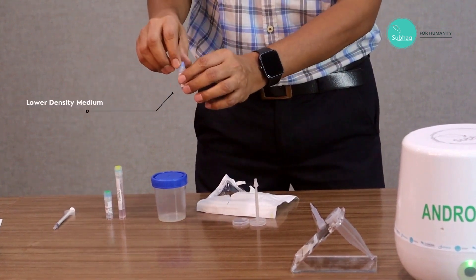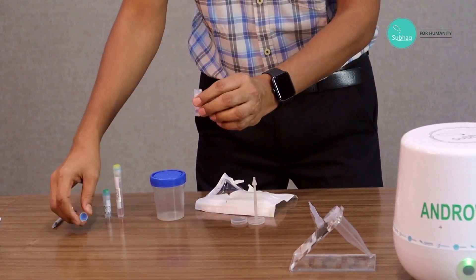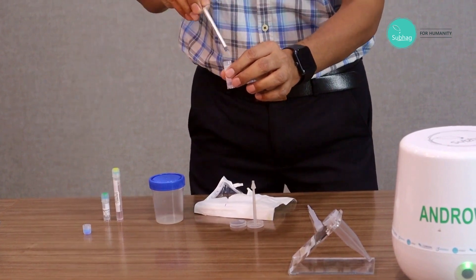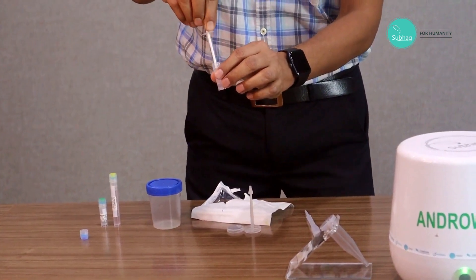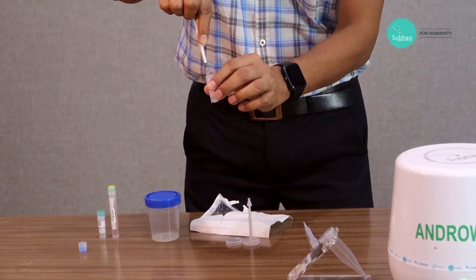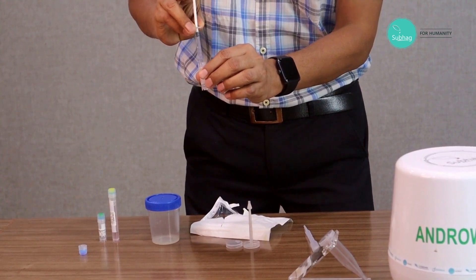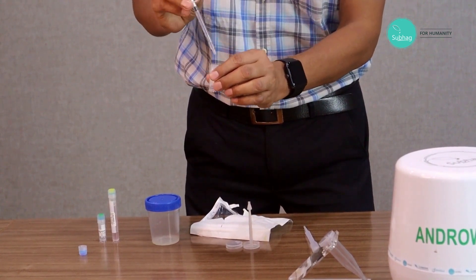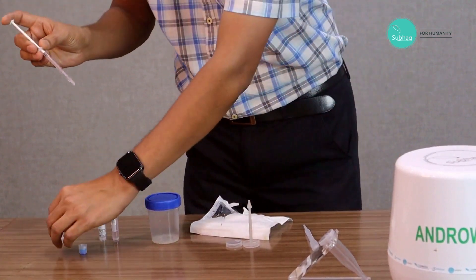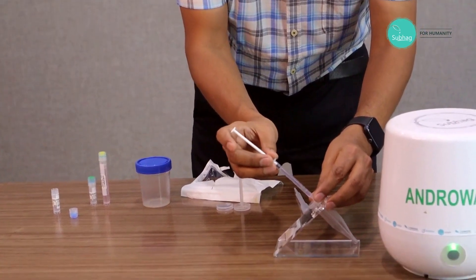Then we take the low density gradient first. We take the entire volume at a time with the help of this syringe — we take it fully — and then attach it to the cap and inject it fully.